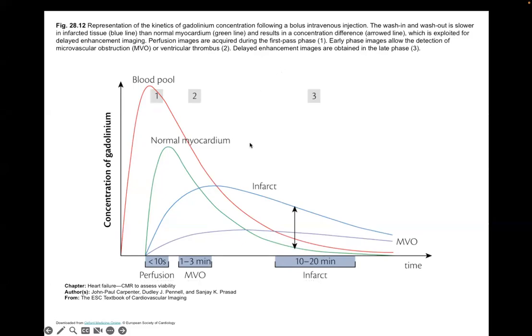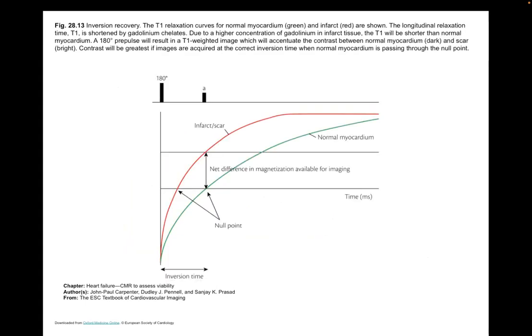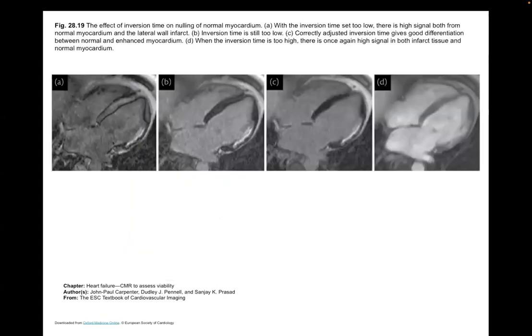application because it's pretty important. It turns out that MR is really good at measuring when a tissue has an infarct in it. And so let me just show you one of the pictures first. So if you look at this MR picture here, that bright signal right there, which is patently obvious. I mean, you don't have to be a rocket scientist to go, hey, this is abnormal.